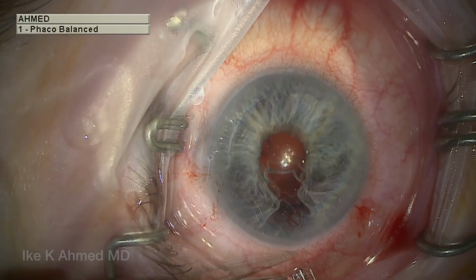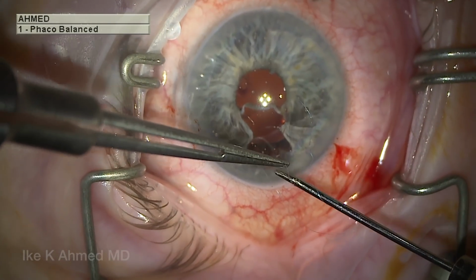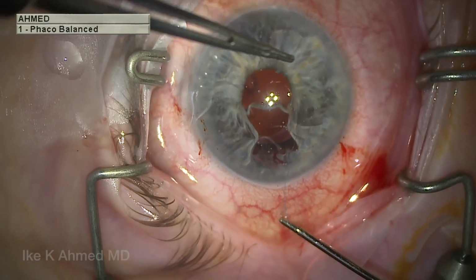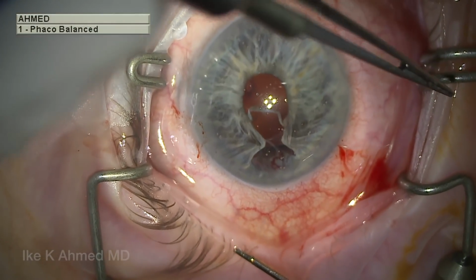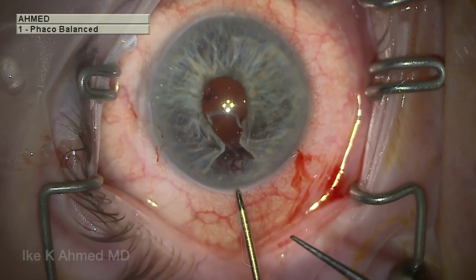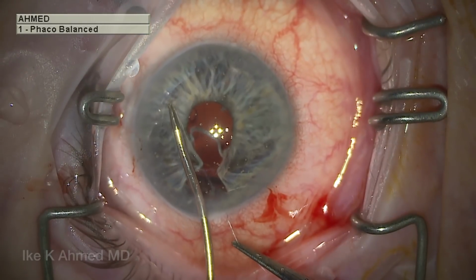Here we're going to extract both ends of the polypropylene suture through a temporal incision. And just like in the McCannel technique, we're going to tie the knot outside the eye, although here we're going to use a micro tier to push the knot into the anterior chamber, thereby reducing the need to bring the knot outside the eye to tie it down or to cut. One can also use a Siepser or sliding knot, although the McCannel technique, as we're describing here, is less complicated.